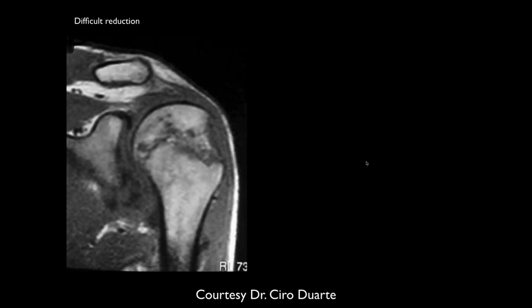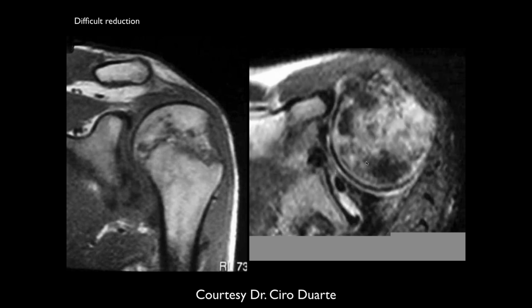So what do you think's going on here, Shiv? Why can't they get it to relocate properly? Could it be because there's an effusion there? Well, the effusion wouldn't keep you from relocating it. What's that dark thing? Oh yeah, okay.